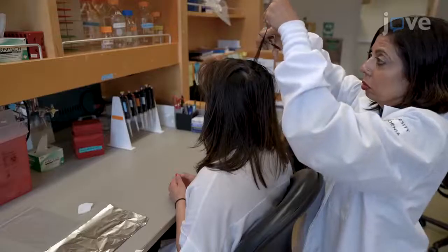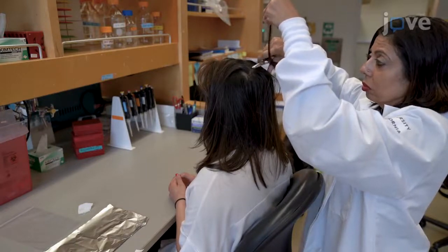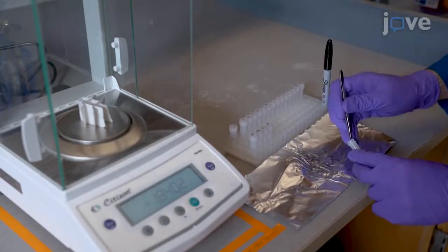We have developed the first multiple analyte mass spectrometry panel for multiple TB medications within small hair samples in a single assay. Our multi-drug panel only requires 1 to 2 milligram sample per patient and uses neither solid phase extraction nor a filtering step, to prevent any loss of sample volume.